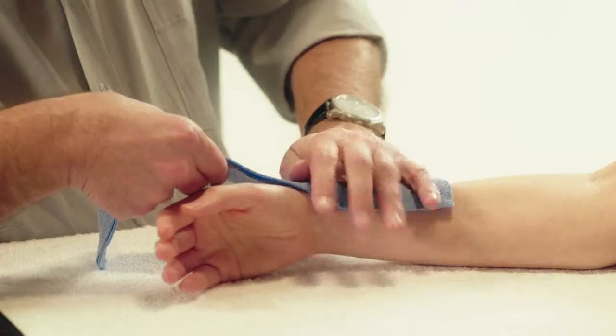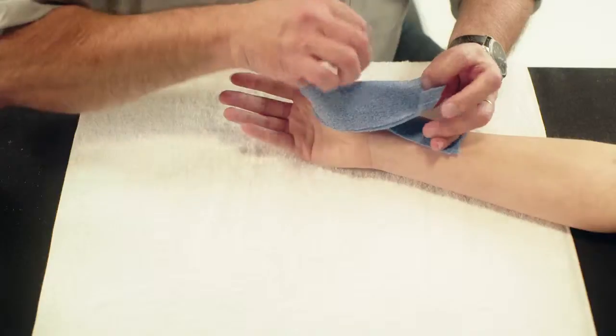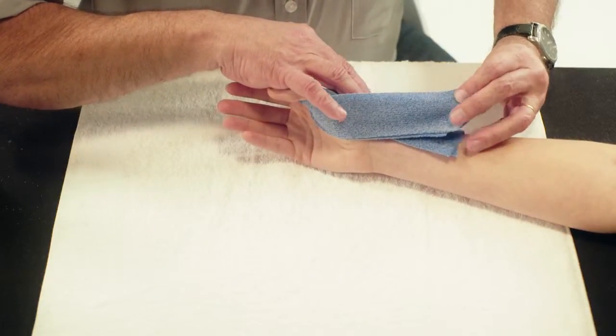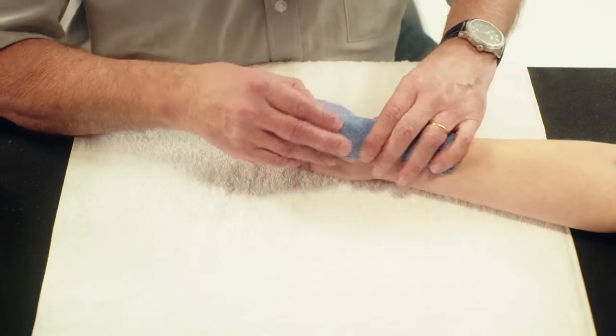Place the Orficast on the radial dorsal surface of the forearm and wrap in the middle around the thumb. Pull through the web space and adhere back onto the dorsal surface of the orthosis.